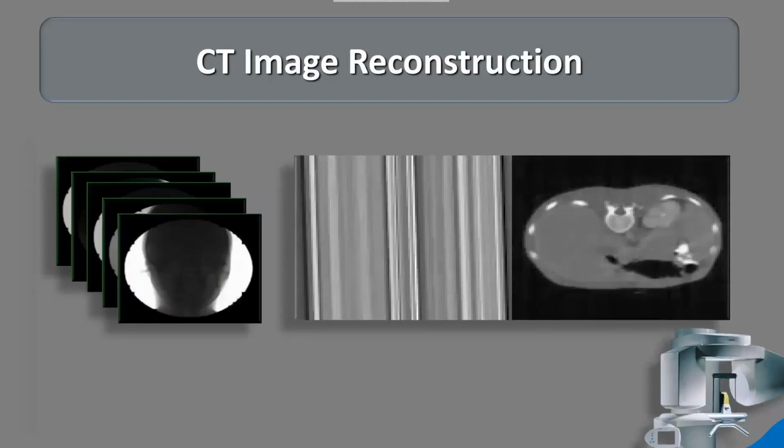Why is it so important to spend time to understand that we are using algorithms? Well, it lets us know that we can continually get upgrades over time through the software. So all of this technology is software driven. In fact, if you've ever wondered how it works with medicine, where those medical CT units are about $1 million, $1.5 million, you better bet they don't want those to be obsolete tomorrow. And the way they are continuing to upgrade them over time is all through the software.